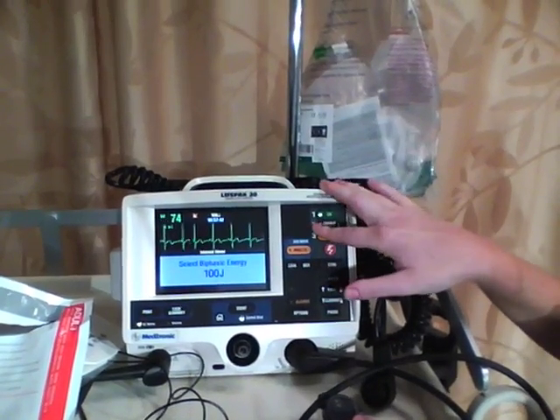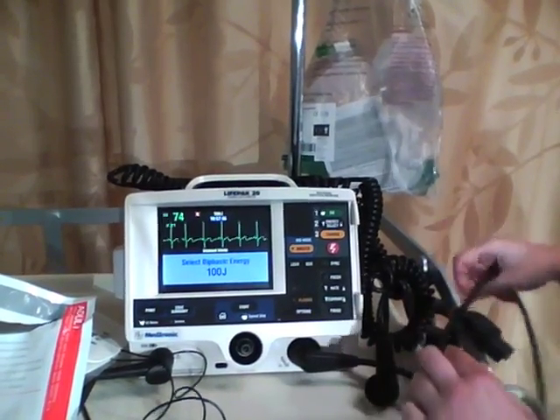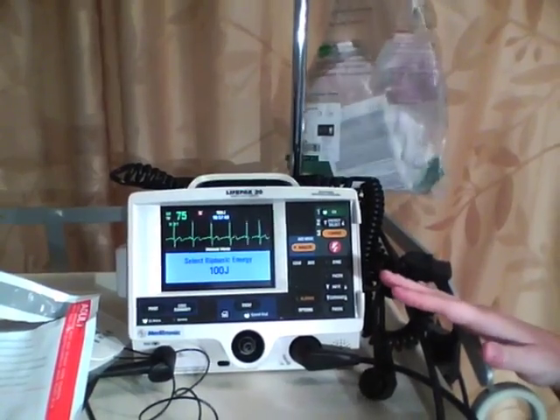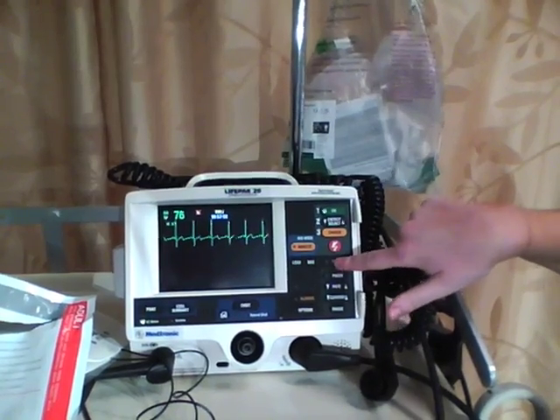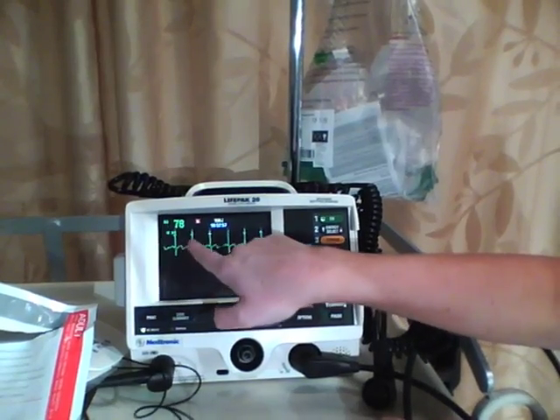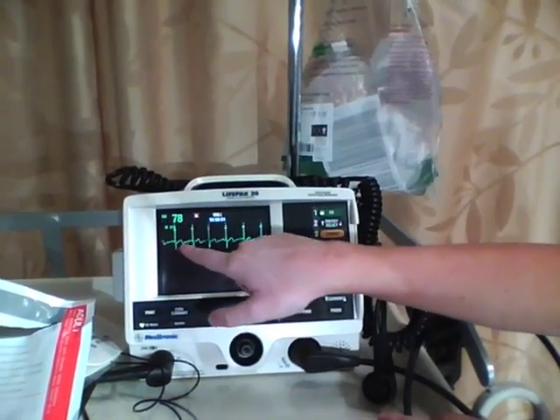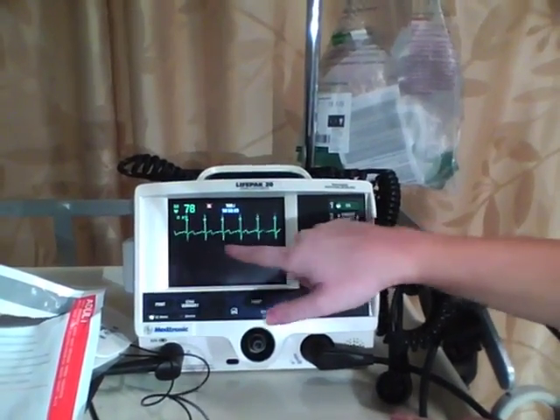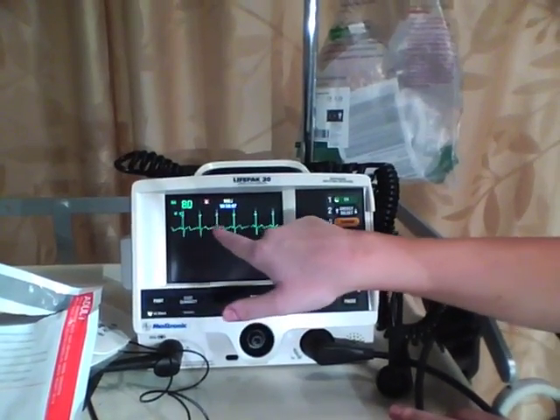We'll stick with 100 joules — say it's a larger patient. When everybody is set up and ready, you want to press the sync button. Sync will then show little triangles on the screen — that's how you know you're synced, so that you're firing on the right part of the complex. If you weren't syncing, you'd be defibrillating. Since we're cardioverting, we have our little triangles.